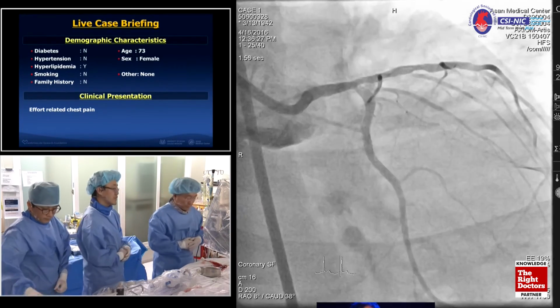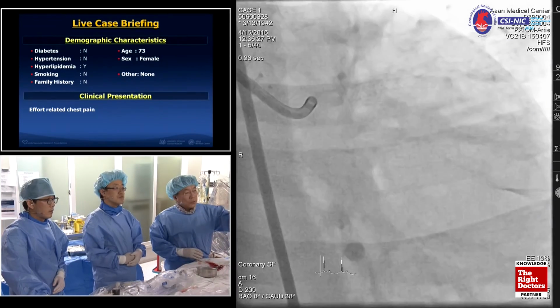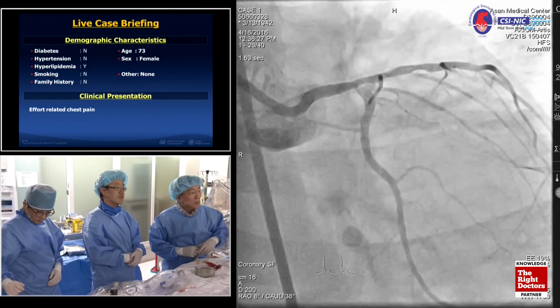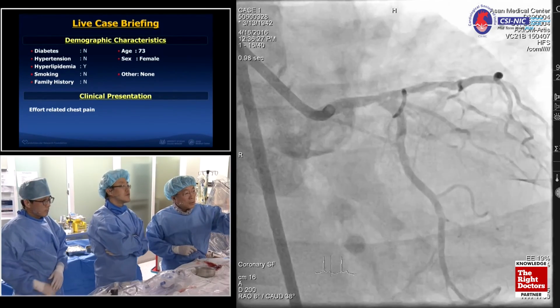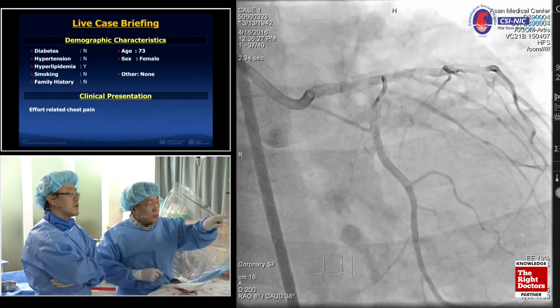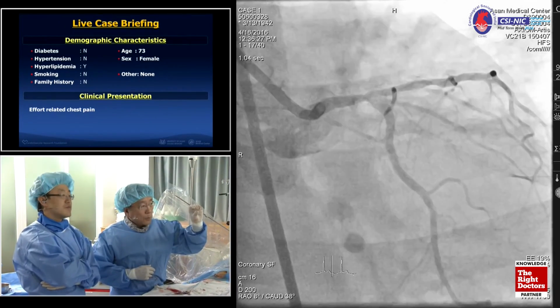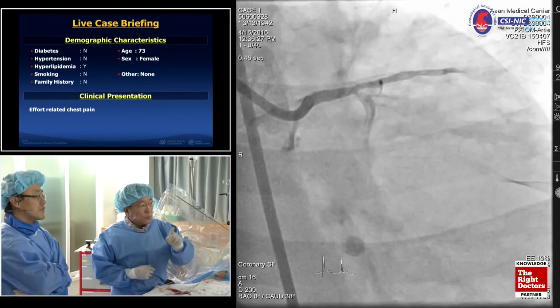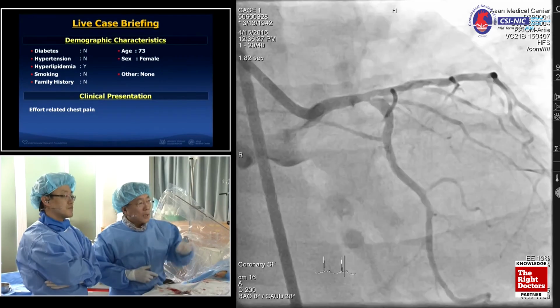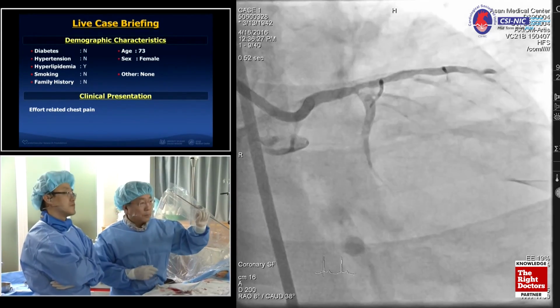Would you show the angiogram? The angiogram shows minimal intimal hyperplasia in the stented segment from the LAD to left main, with intermediate stenosis, and critical narrowing of the circumflex ostial part, very discrete.